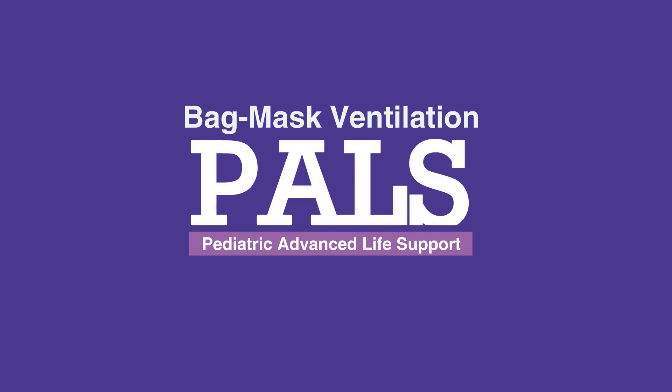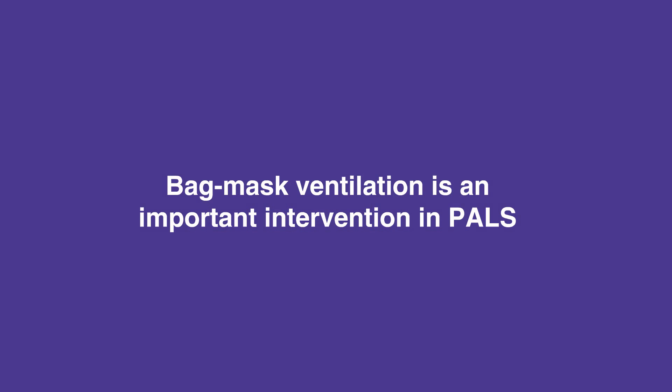Welcome to the lesson on bag mask ventilation. In this video, we'll discuss how to perform bag mask ventilation. When performed appropriately, bag mask ventilation is an important intervention in PALS.